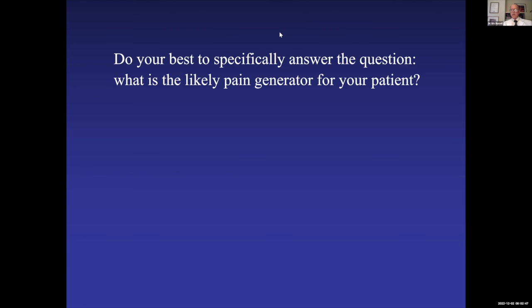Yes, I didn't touch on it because of the length of the talk, and it's not something I do clinically, although occasionally, and we're not using that routinely here yet, although there's quite a bit of literature on applying nuclear medicine studies and PET studies to these types of issues, looking at bone marrow uptake of tracer. So certainly I'm not going to get into the details of what to look for and what to do, but yes, I would suggest that everybody try to review the literature and see if it fits into their practice pattern. FDG PET and other tracers may be useful.